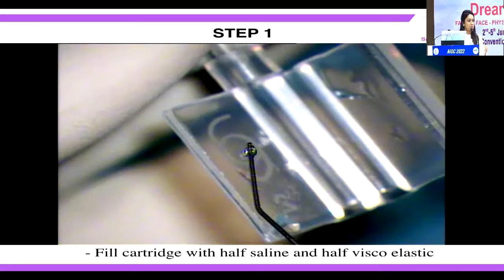Coming to the loading of the lens, the first thing is, whenever we are doing a phakic IOL, we load the lens first, rather than operating on the patient first. Why so? Of course, in IPCL, we have a backup lens, but it's always a good habit, because it's a premium surgery, on young patients. You don't want to make an incision and then load and see that you have a disturbed lens architecture. So always load the lens and then start the procedure.